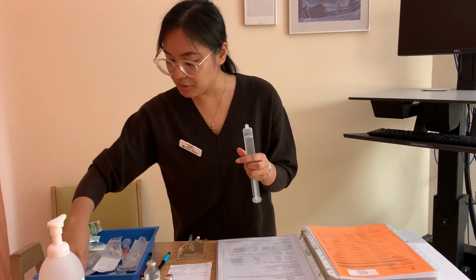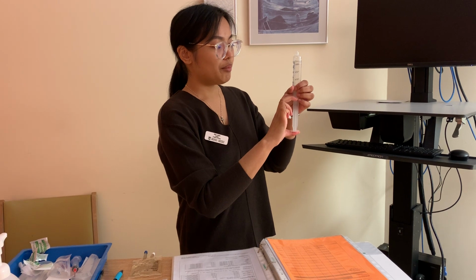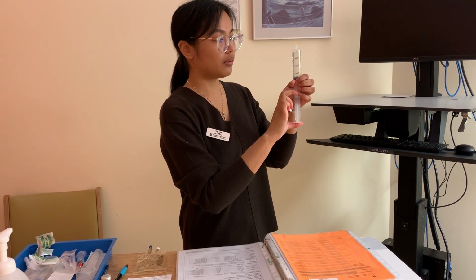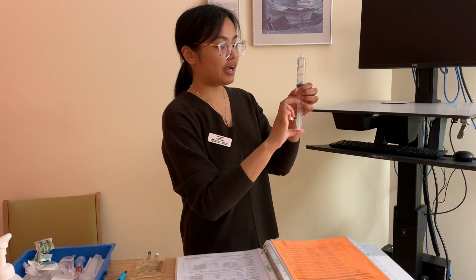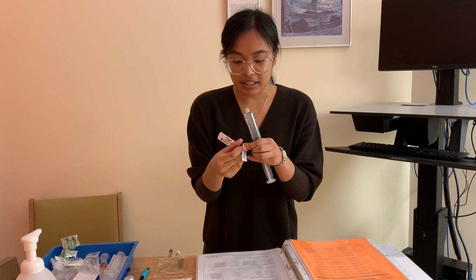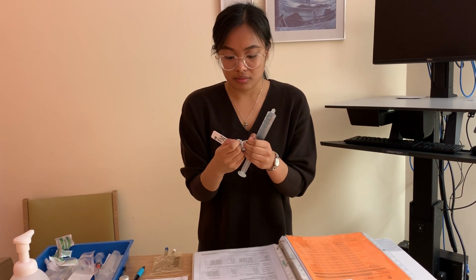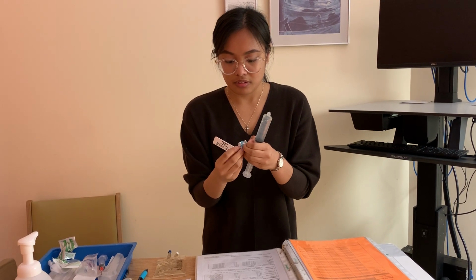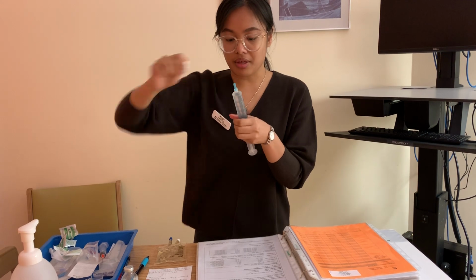So I have here my blue cap. I'm going to make sure it's my 25 ml total. So I'm going to make sure it's all the way up. First, there's a black there, so that's great. And I'm going to maintain sterile technique, wing this part back. You have 13 something? Okay, not touching it, I'm going to put the blue cap on.